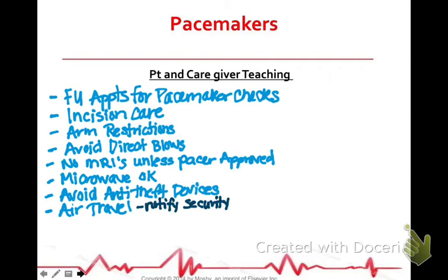And then air travel, you want to definitely notify security, because you could set it off.